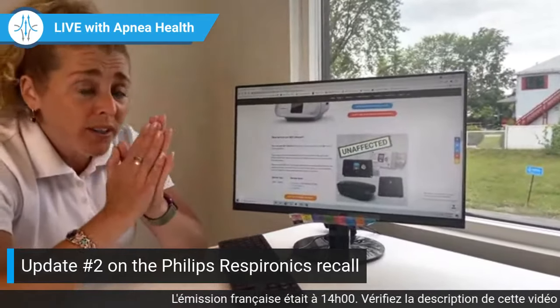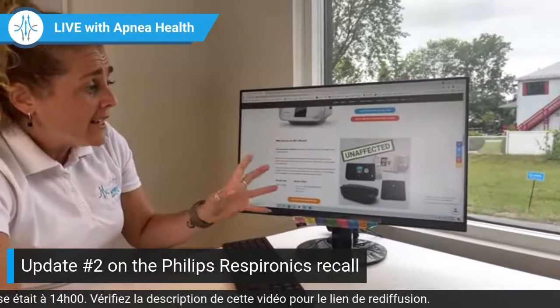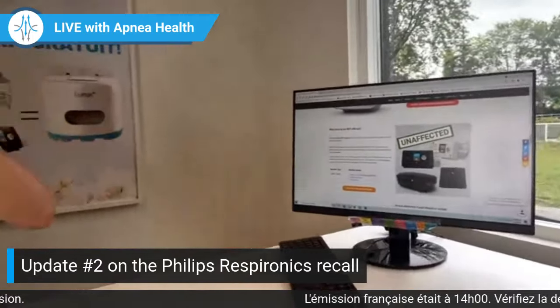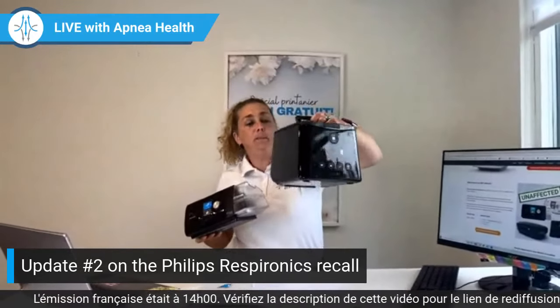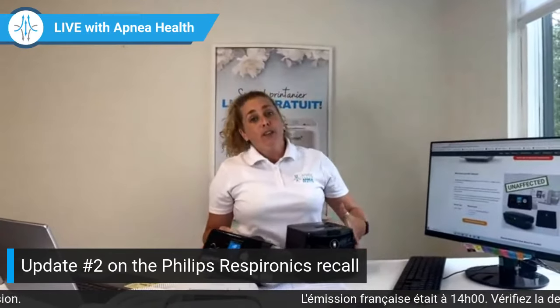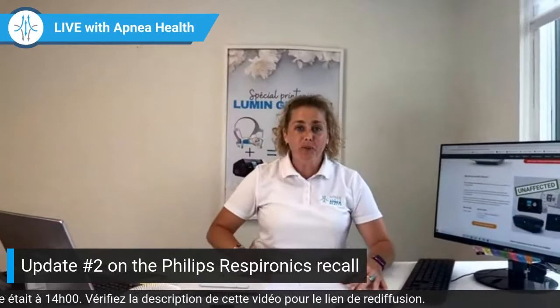Also, important to know, and I need to reassure you guys, the devices that are unaffected are from ResMed and Fisher & Paykel, and DreamStation 2 is not affected. I'm going to show you them here. I have them with me. ResMed AirSense S10, a perfectly good CPAP, and SleepStyle from Fisher & Paykel, and any other old devices from those companies are not affected. So rest assured, and the DreamStation 2 is not affected either. That's good news, right? With all this commotion from the recall.